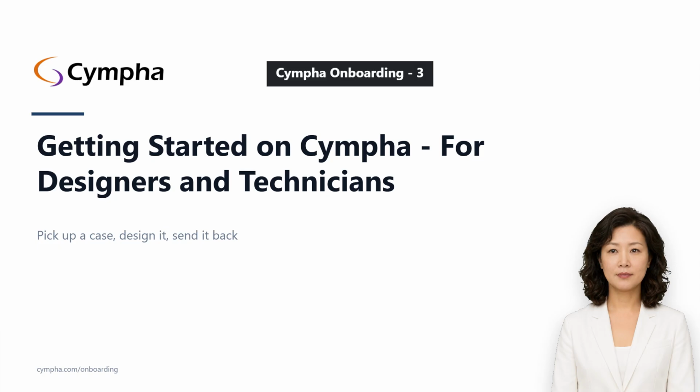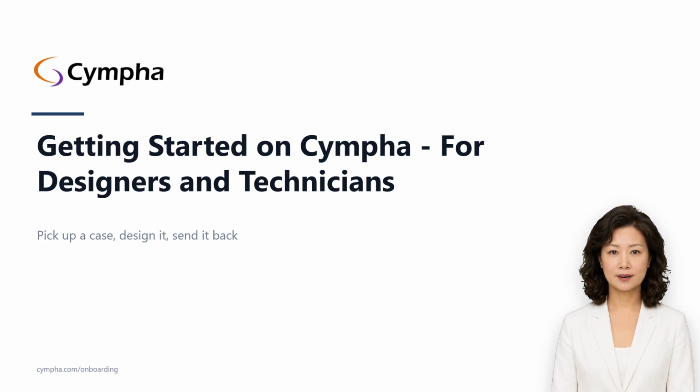3 names first. Guide Mia is the company. Cympha is the online platform where cases reach you. Guide Mia also makes the desktop design programs, Implant Master and OrthoPlus, which run on Windows and which your lab licenses separately. Our example is Maria Garcia, a designer at Apex Dental Lab.